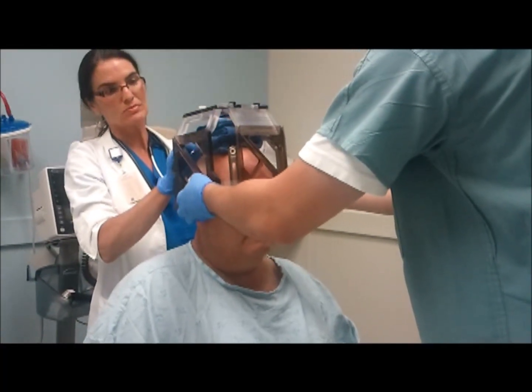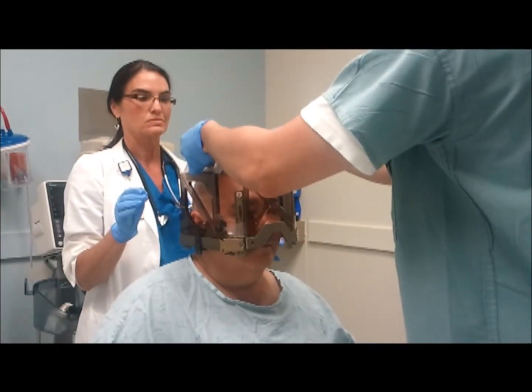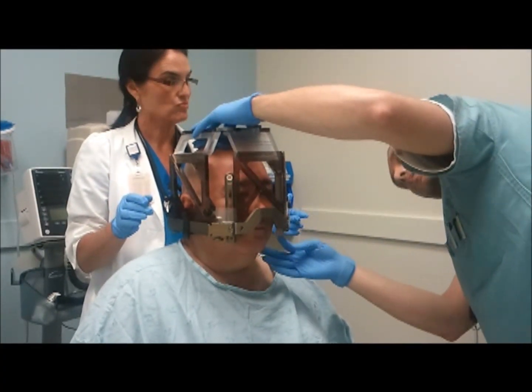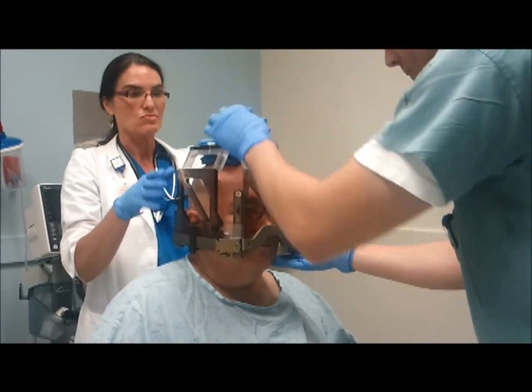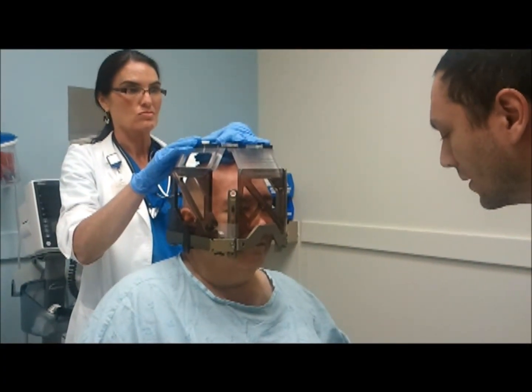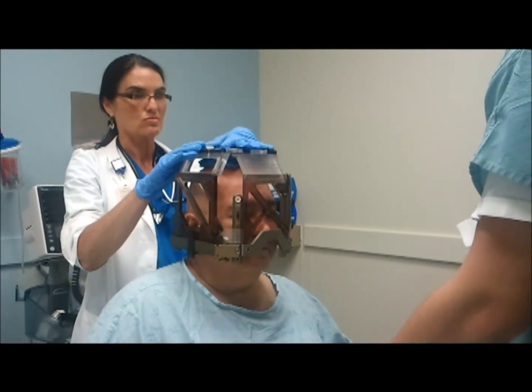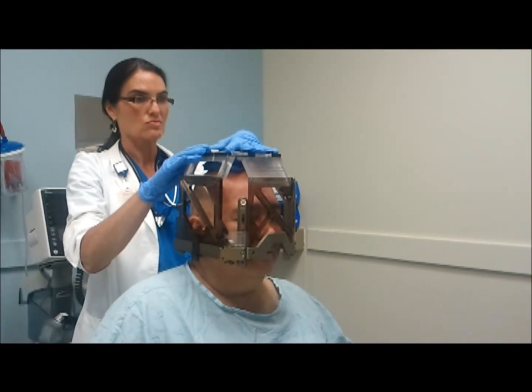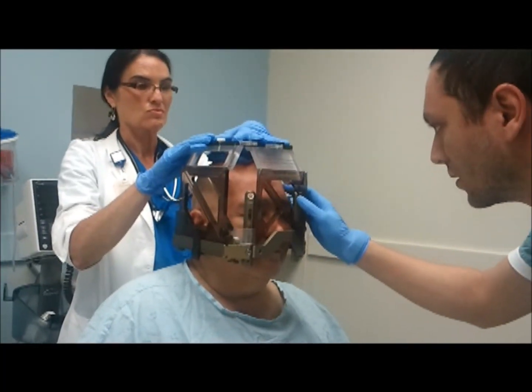Let's take one of the towels. And the second thing we're going to do now is give you some of that numbing medicine. For the numbing medicine, I would like you to keep your eyes closed. I'm going to give you those small towels so you can wipe your eyes if the numbing medicine gets close to them. Let's just close your eyes and relax.